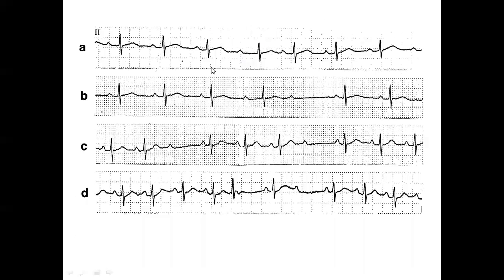Interesting patient, sinus rhythm, all of a sudden, PR lengthens. Next moment, PR short, long, blocked, typical Wenckebach phenomenon. Next moment, PR doesn't change, but all of a sudden, the regularly occurring P is blocked, typical type 2 second degree AV block.